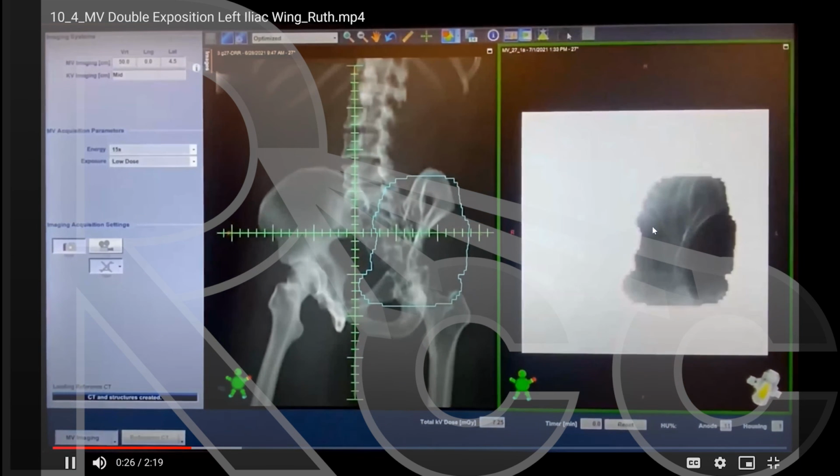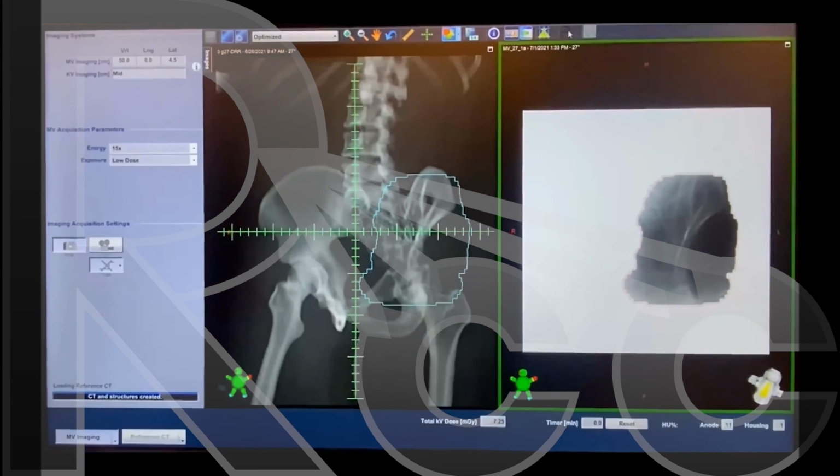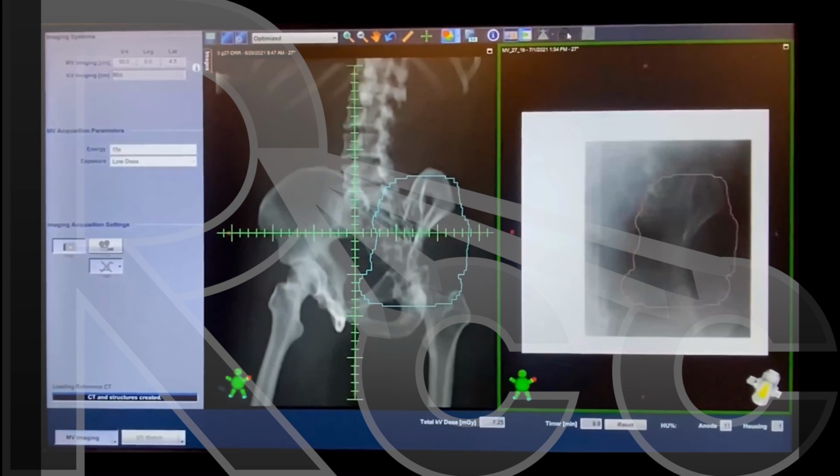So what they've done is they've taken, and you can see here, I can't see if I'm in the right spot. I think I am kind of in the general area, but I need more information to be able to assess where my treatment field is. So I've taken my field image, and the little MLC leaves are very evident there. They also put on a digital MLC, which can be helpful as well. And then we go ahead and we open up those leaves, open up the field size to just get more imaging information in there.